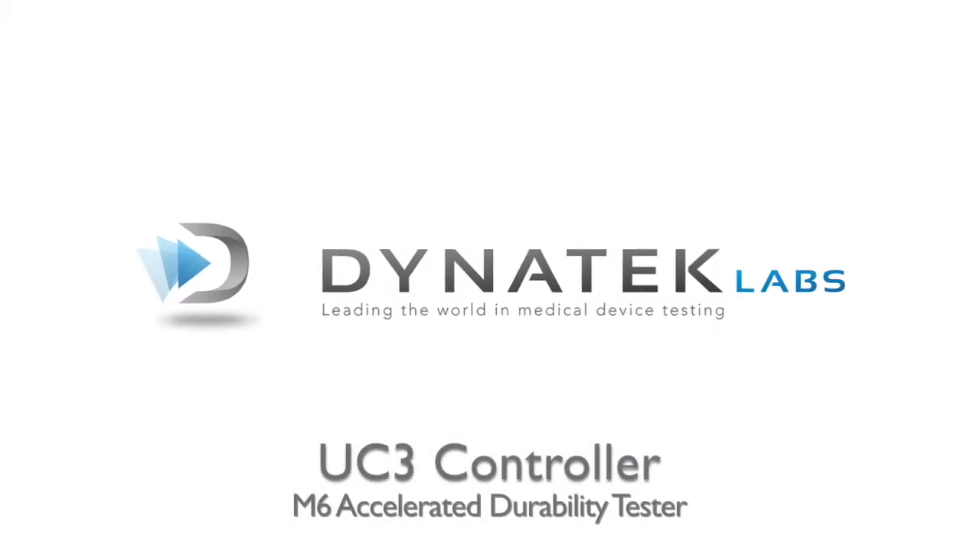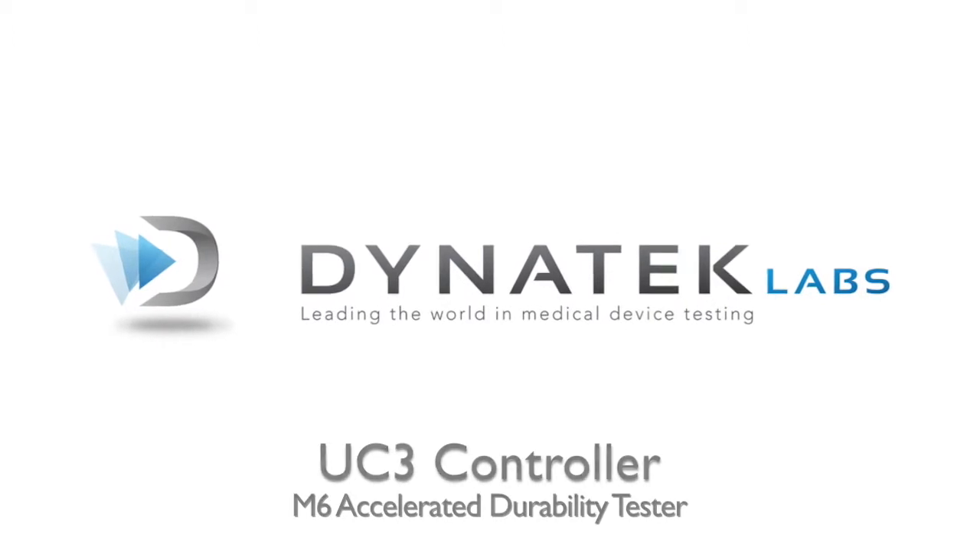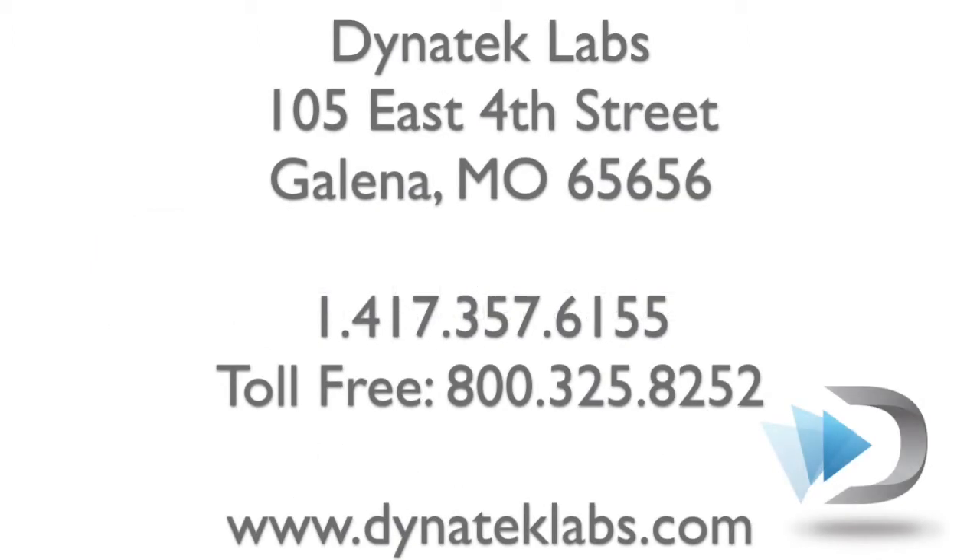This has been a demonstration of Dynatec Lab's UC3 controller, designed for use with the M6 heart valve tester. Contact us today to see how we can fill your cardiovascular testing needs.